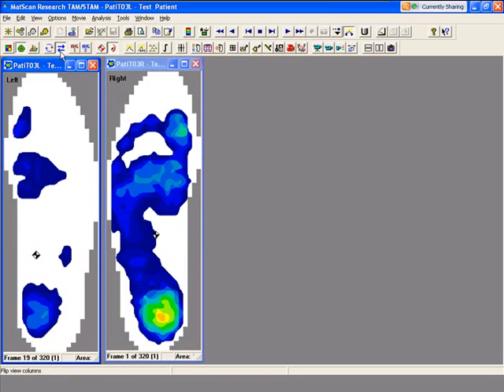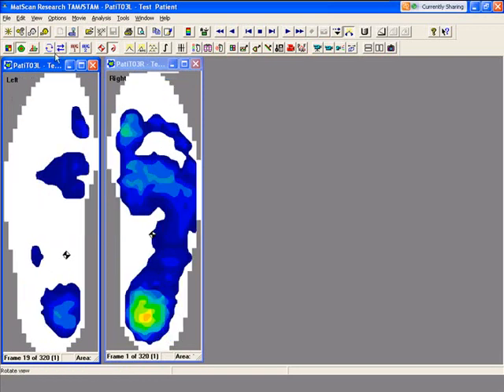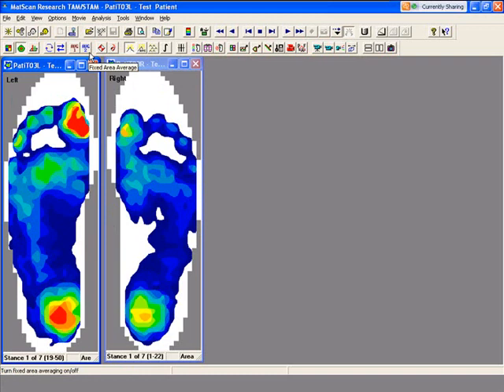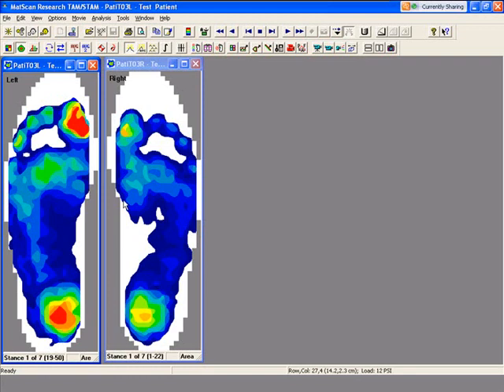Now we're going to look at the average 1 and average 2 feature. What average 1 does is it averages the whole sensor, even dead zones. You'll notice there's a dead zone here and a dead zone there where there isn't any pressure.